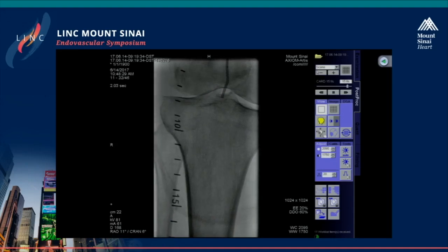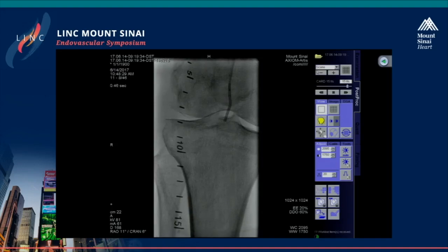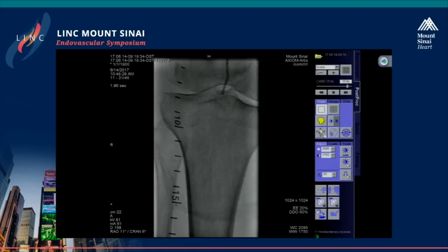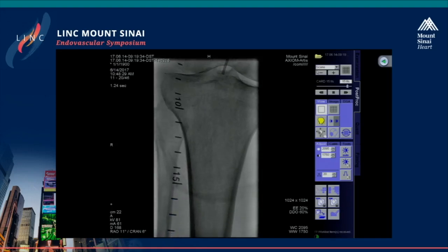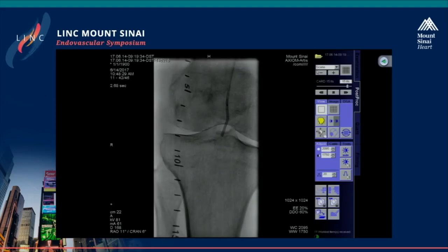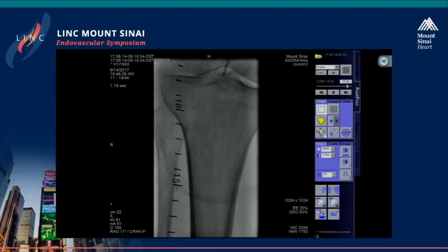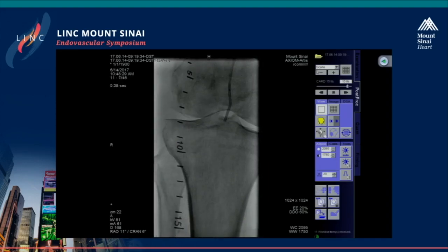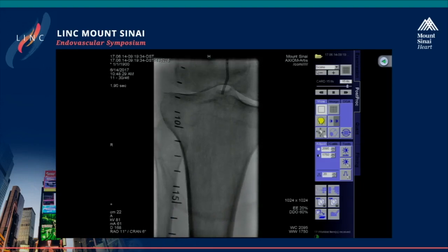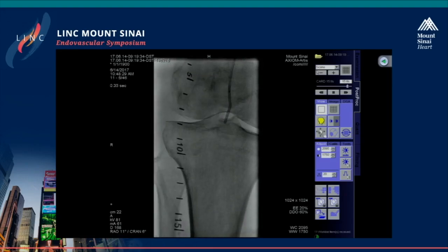We decided to go with an 018 tip load. We went with the Terumo gold tip. It's called the M, right? Terumo M wire. And then we use the 035 catheter as support. We're likely going to track the catheter into the tibial if we're lucky enough to get through. So we're going to get started, and you guys can let me know what you would do. Most importantly, I really need advice from our expert panel on how they would deal with the popliteal as well as the SFA if we're lucky enough to cross this. So we're just going to get started. I'm just starting wiring.